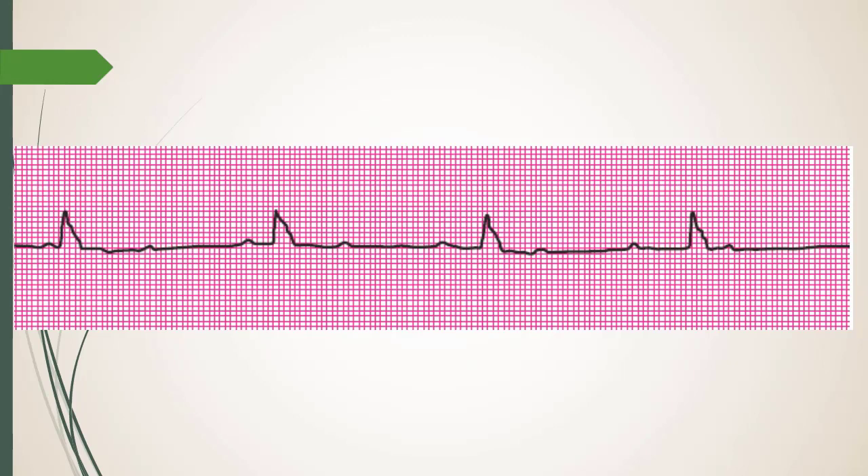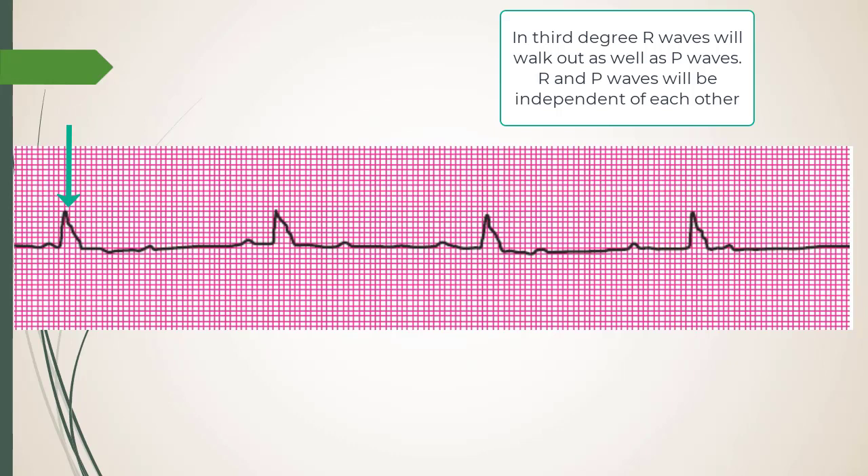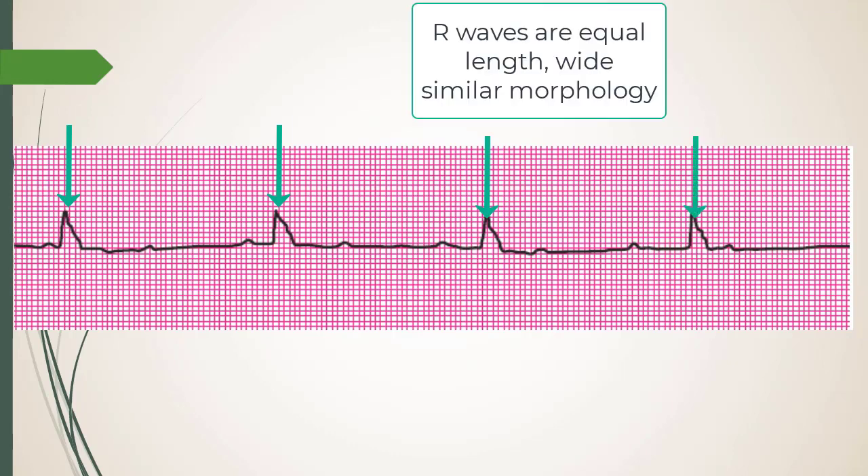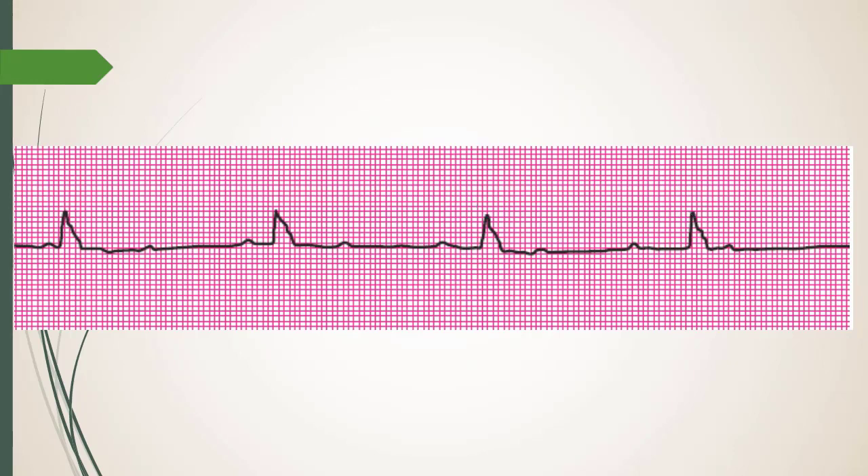So I check: are the R waves exactly the same distance apart? If it's coming from one focus, they'll be exactly the same — that's called marching out. On this strip: this matches, this matches, as you keep going it matches. Strong indicator that it's a ventricle firing on its own.